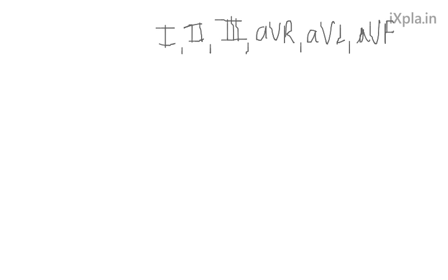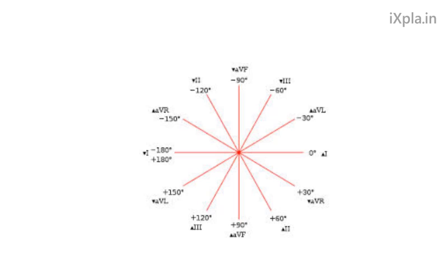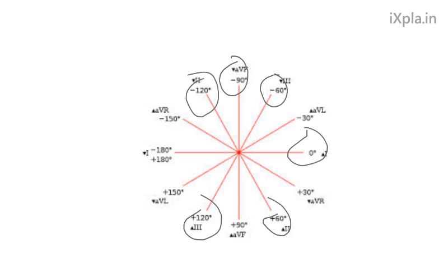And then you need to know the exact angle when you do mean axis. That's why that circle is very important to know, because you have to know the corresponding negative angles for certain ones. It's easy to remember 0, 60, 120, 90, 150, all that stuff. 150, that was negative 150. But more importantly, you need to know how they're formed.